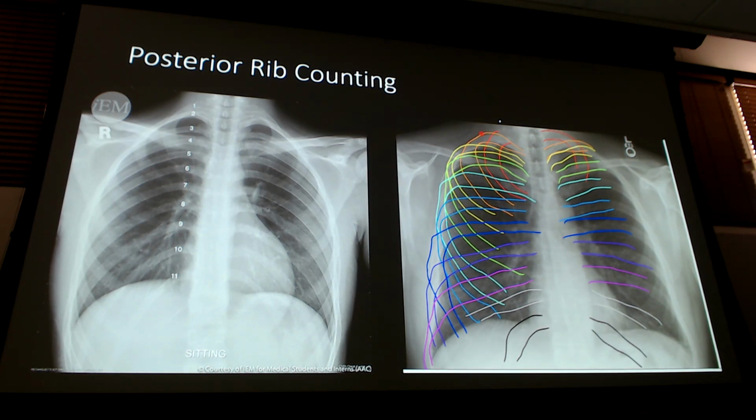They stop right here and turn to cartilage and come up, right? We can't see cartilage that well on x-ray. Cartilage isn't seen well on x-ray, which is why we do MRIs for your meniscus, soft tissue. There's cartilage in the knee, there's cartilage in the labrum and in the shoulder joint. You can't really see cartilage.